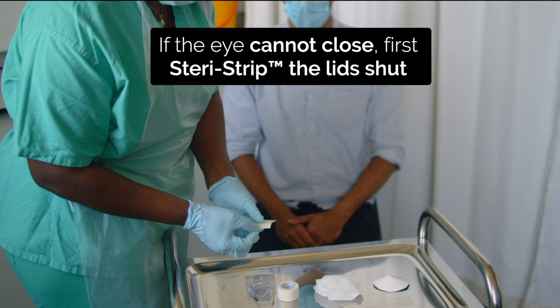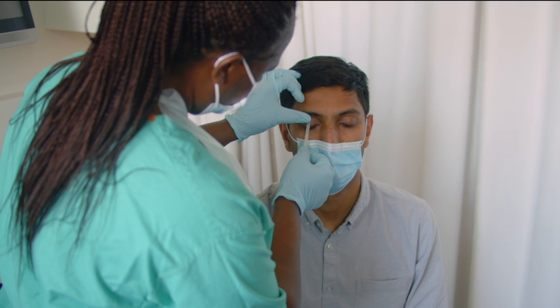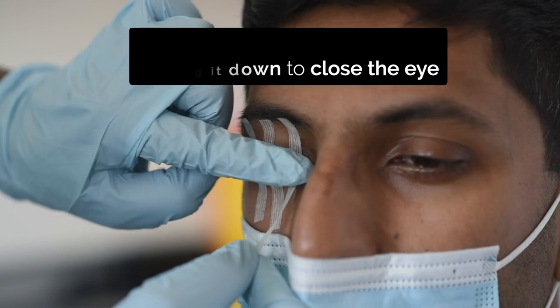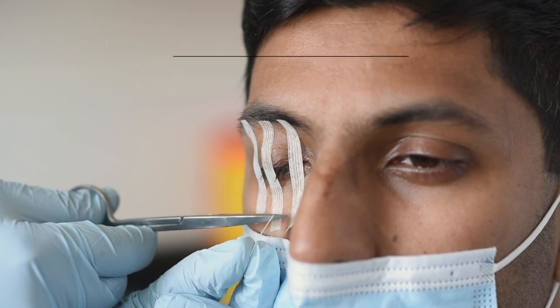If the eye cannot close, then first Steri-Strip the lid shut. Ask the patient to try to gently close both eyelids. Place the strip on the upper lid, pulling it down to close the lids, then stick to the lower lid and cheek. Use two or three Steri-Strips.